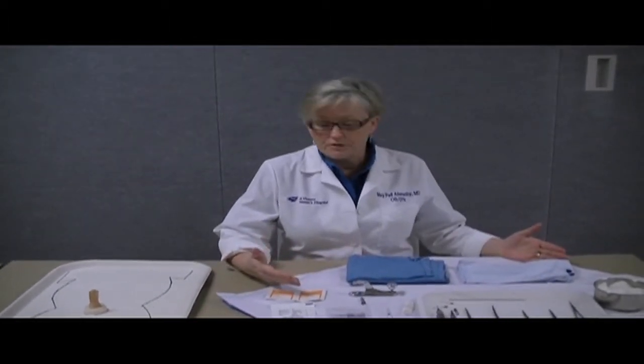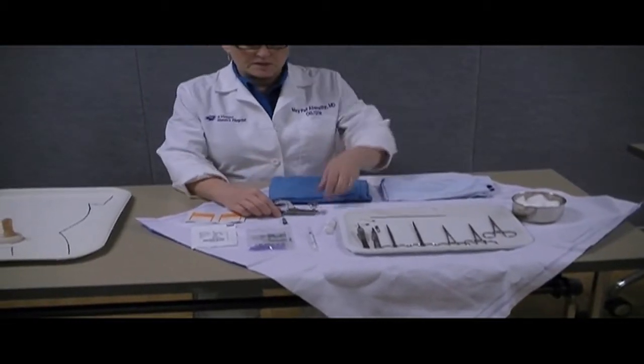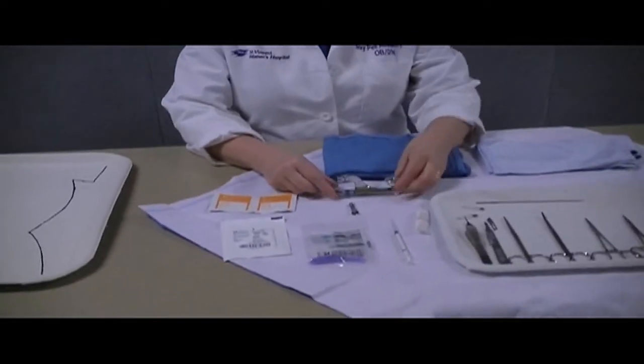After that, we obtained a circumcision tray from our labor and delivery. It contains all the items that we need. Today we're going to demonstrate on a Gomco clamp. You can also use a Mogen clamp for this as well.